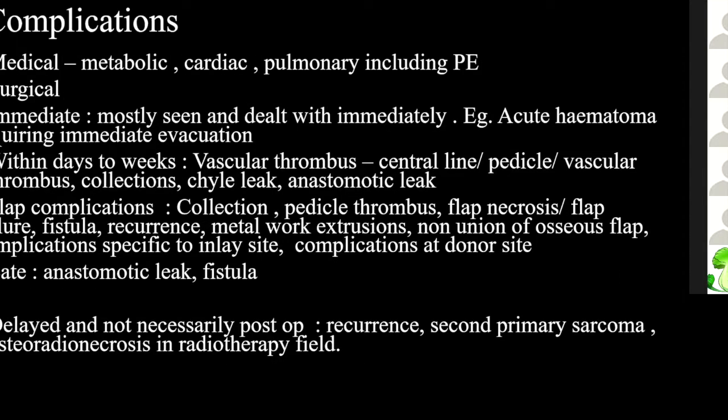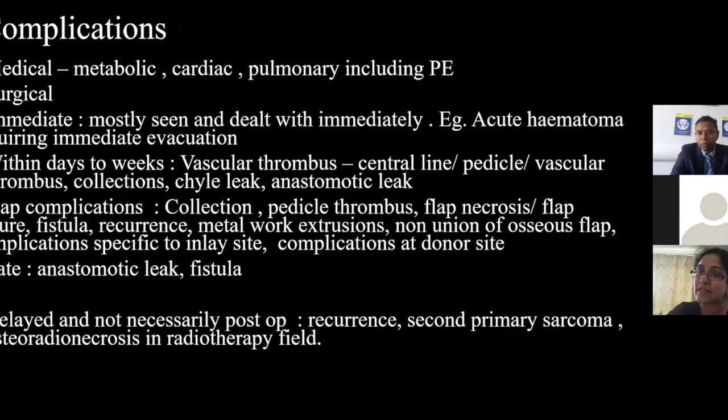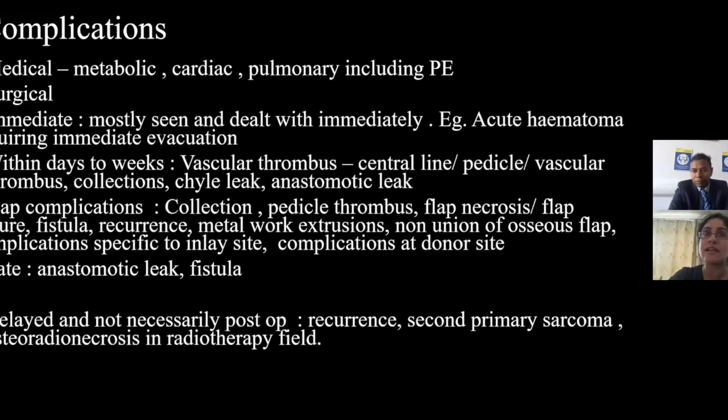Some of the complications are medical, and I'm not even going to touch that. Some are metabolic, cardiac, pulmonary complications, including PE, which can be assessed with CT. Now, surgical immediate complications we don't even see in radiology because as surgeons, you see it, you assess it, and it's sorted. But the slightly later ones, which go from days to weeks, to maybe months, and maybe even after years, those are the ones that we tend to see. Flap complications need an entirely different chat because flaps are so complex.